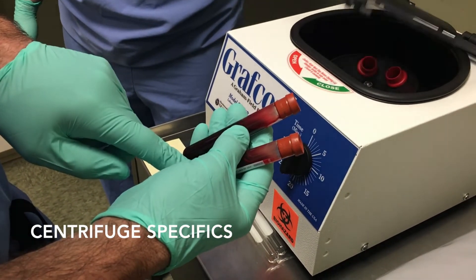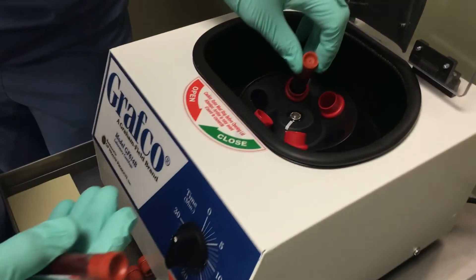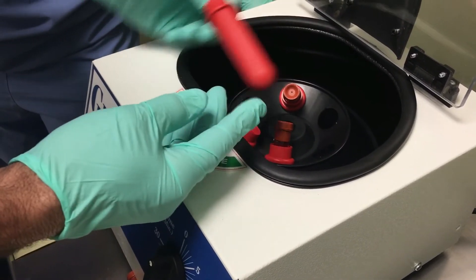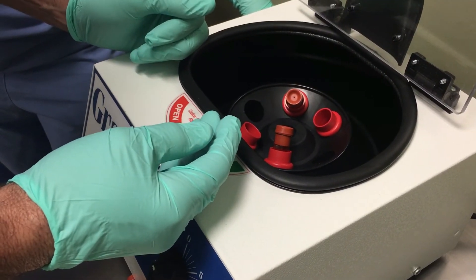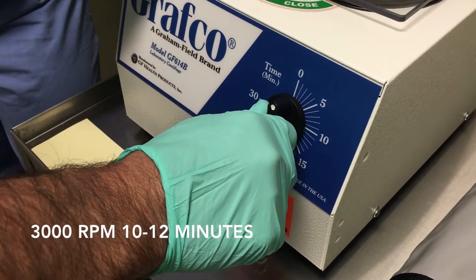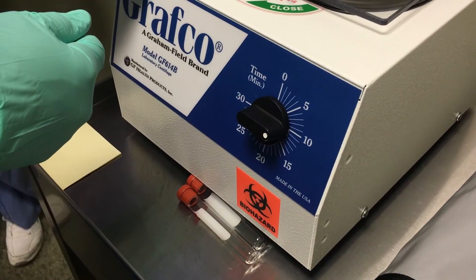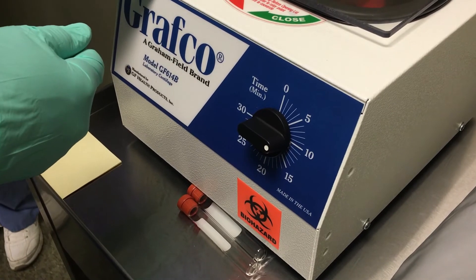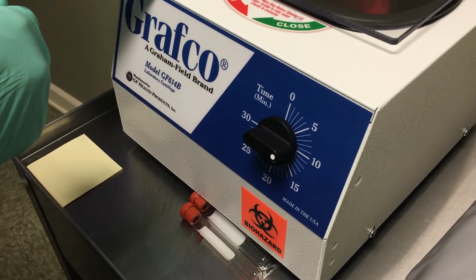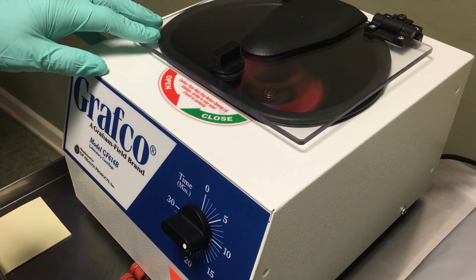We've taken the two blood collection tubes with the blood in them and we're going to put them into our centrifuge. You place tubes on opposite sides of the centrifuge wheel. I have places for four tubes if needed, but place them opposite each other. Close the lid, lock the lid, and then we go 3,000 RPMs for 10 to 12 minutes — depending on which articles you read, it's 3,000 to 3,500 RPMs. This unit runs between 3,000 and 3,250. We'll spin this, pull it out after 10 to 12 minutes, and we'll have our PRF ready to process for placement over our implants.